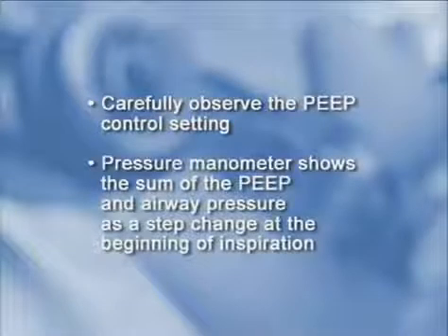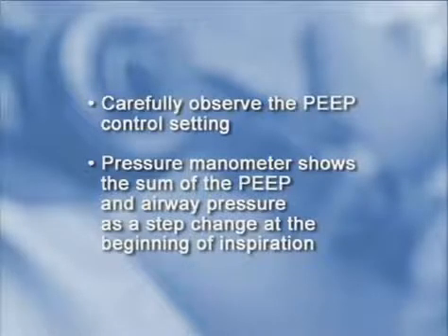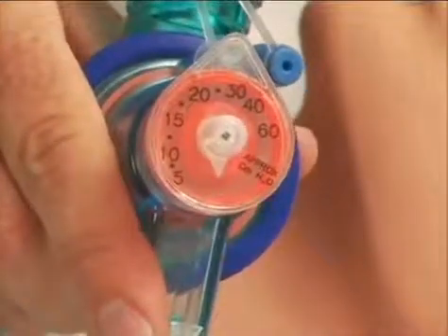The pressure manometer shows the sum of the PEEP and airway pressure as a step change at the beginning of inspiration. The manometer also lets you observe the effect of subsequent PEEP changes. Another option to seeing PEEP would be to add an external manometer to the patient valve.